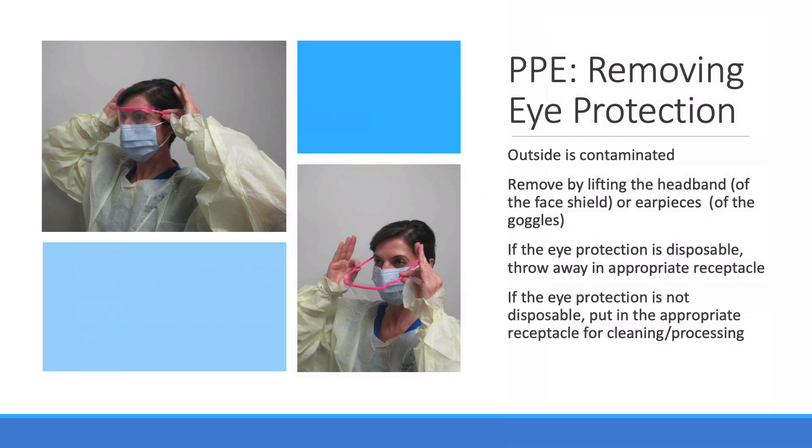Now we'll remove the goggles. Don't touch the front of the goggles or face shield — that's the contaminated area. You'll grasp either by the headband if you're using a face shield, or the earpieces if you're using a pair of goggles. If they're disposable, throw them away. If not, make sure they go into the designated dirty goggles bin for sterile processing and/or cleaning.